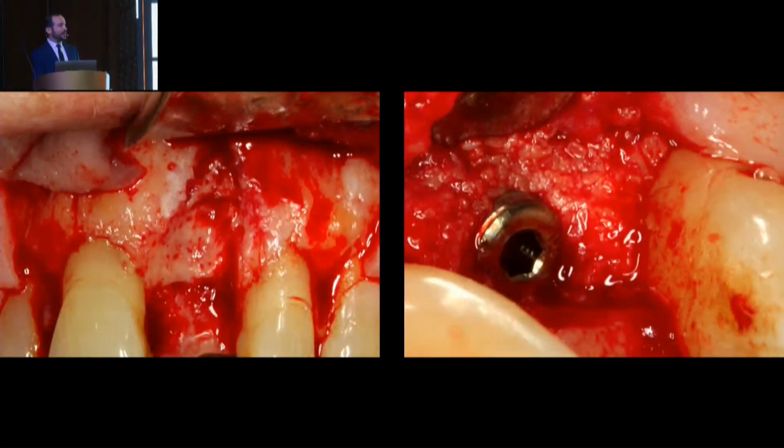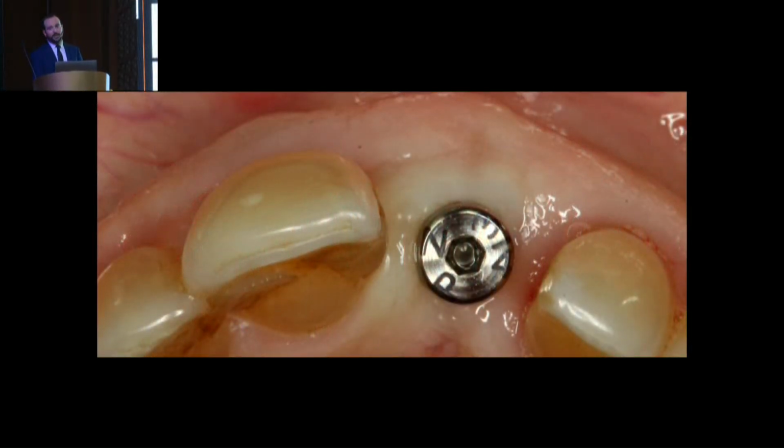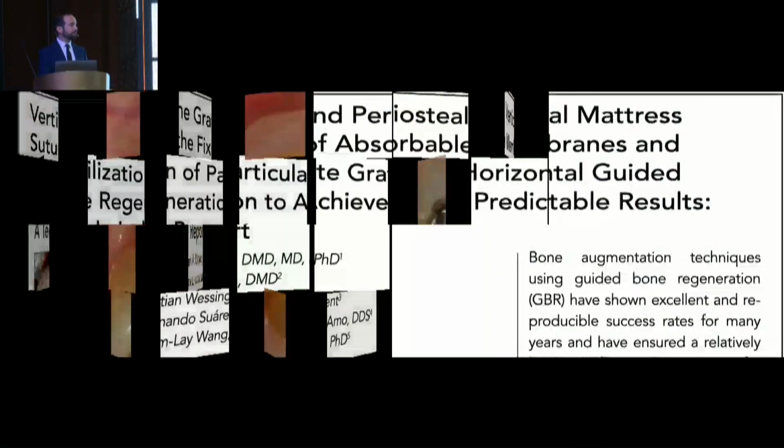Here we can see a comparison of the bone volume that we were missing prior to guided bone regeneration, and what we obtained several months later. We place our clean abutment and we will send the patient to the restorative department to start with the provisional phase and the final restoration delivery.